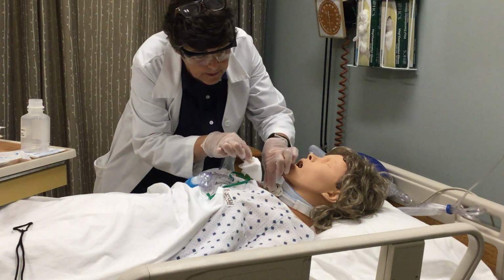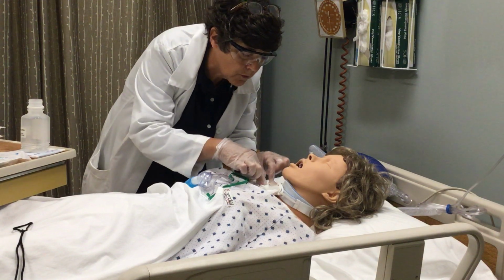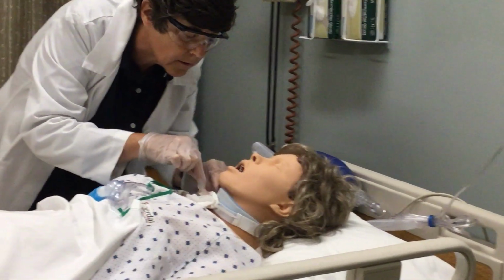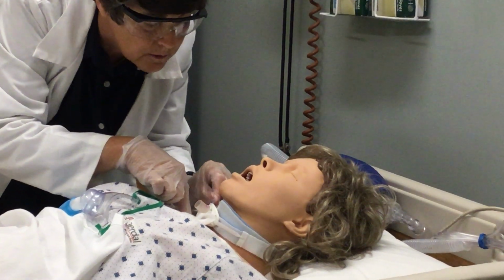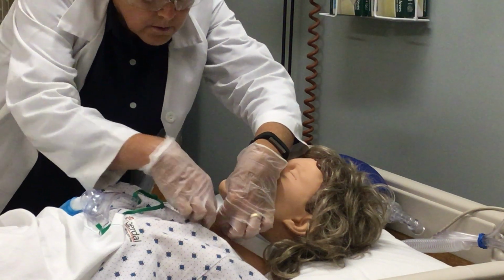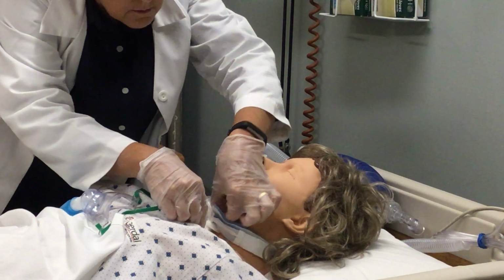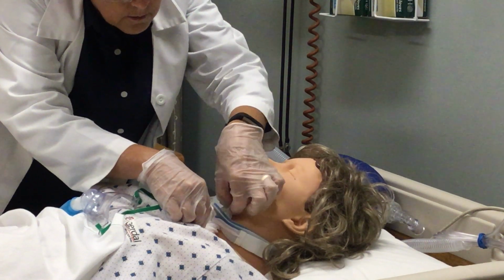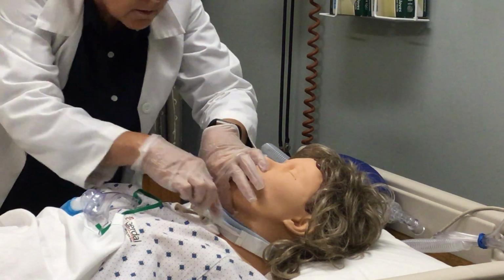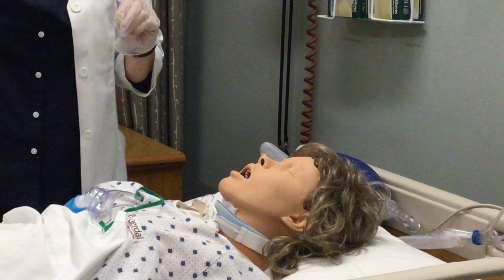And all you do is tuck it under the flange and then pull the little pant legs, or cut parts of the drainage sponge. And I get out all the wrinkles as best I can so we don't get any more skin breakdown.